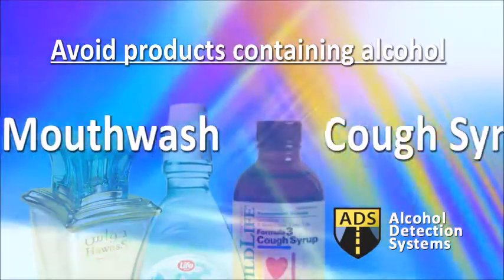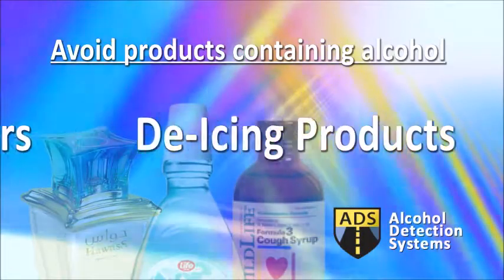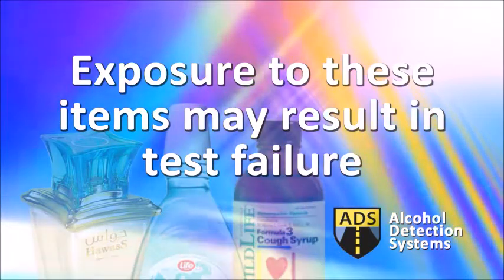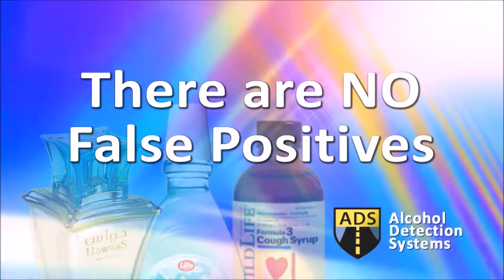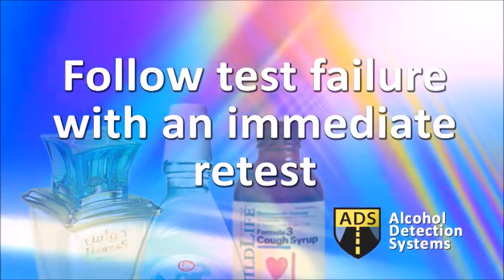Avoid other products containing alcohol. Items such as mouthwash, cough syrup, cologne, perfume, hairspray, hand sanitizers, and items designed to de-ice may contain alcohol. If you are exposed to any of these items, you may fail the tests. There are no false positives, as the device did detect the presence of alcohol. Once you realize this issue, following up with a clear sample is your primary objective, should this occur.